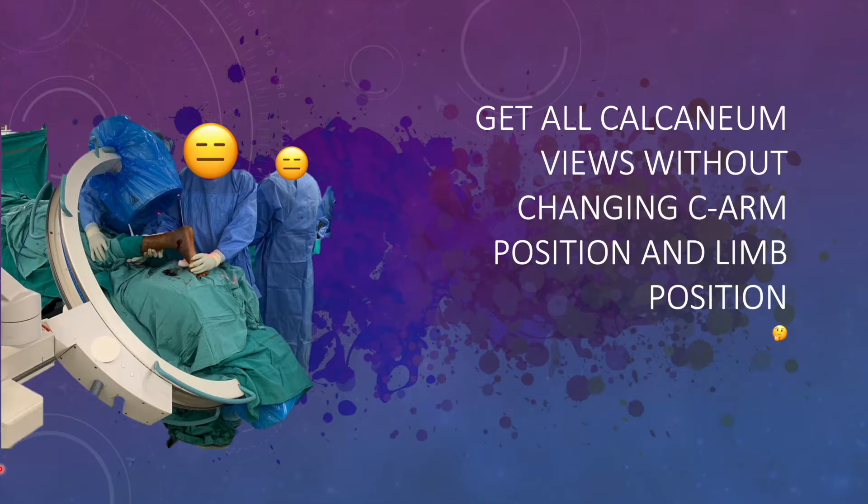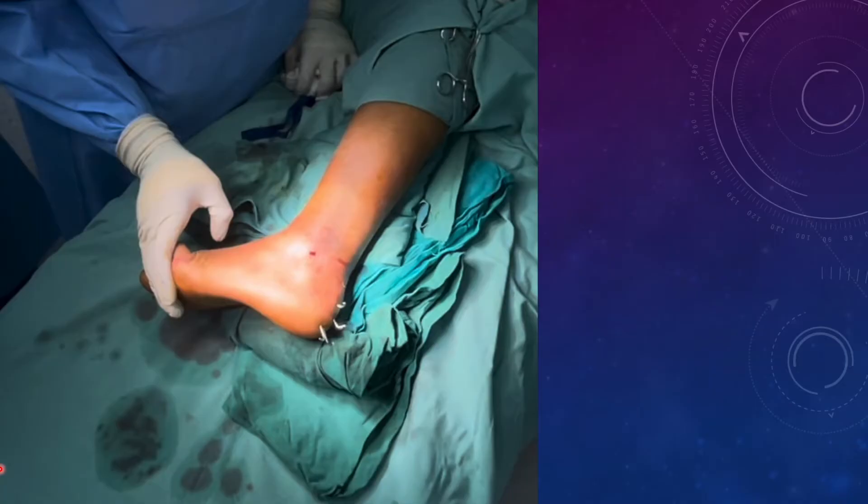You need not change your C-arm position again and again or change the limb position again and again, because often we find residents struggling to get a good view, especially the axial view. So in this technique, I'll show you how to get the fluoroscopic views with ease.